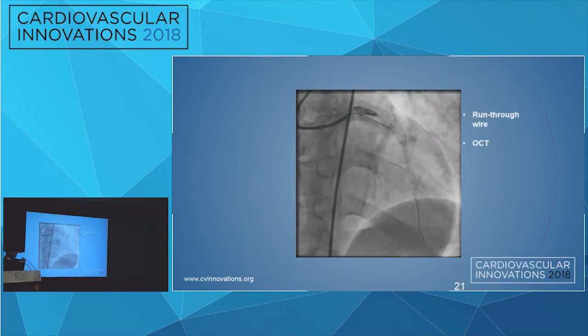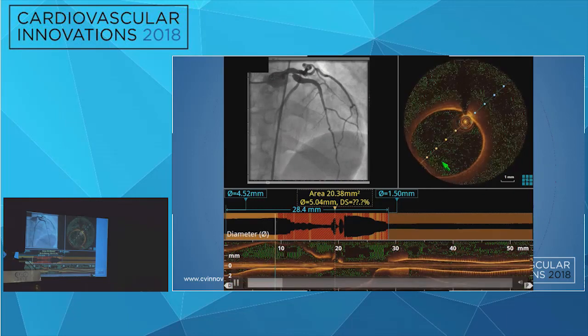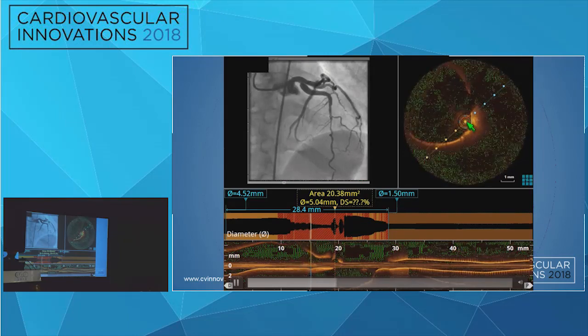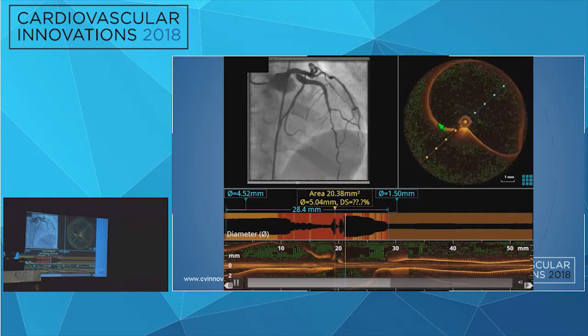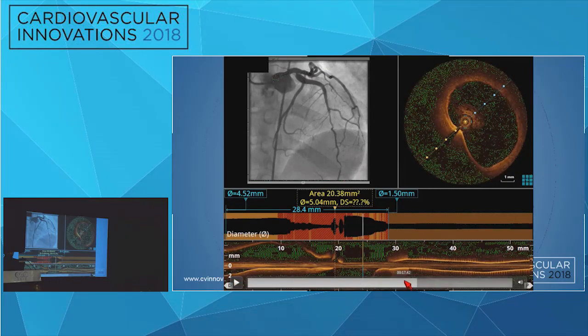And we did OCT. You can see it's a really big vessel. Don't worry about this, this is just artifact from a huge vessel. You see how the OCT is biased into the other wall here. So there is no evidence of atherosclerosis. Here's the transition from the LAD to the left main. I will repeat that because that's the key here.